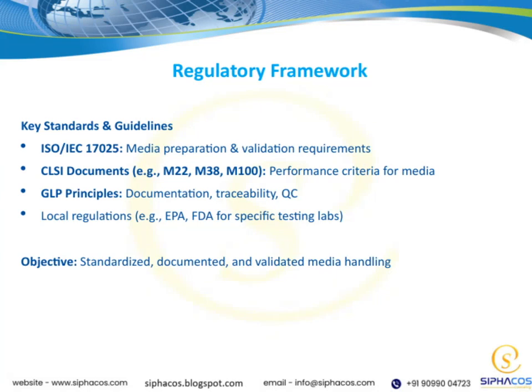Let's take a closer look at the regulatory framework that guides our media preparation and validation processes. First, we have the key standards and guidelines that set the foundation for quality and consistency. One of the most important is ISO IEC 17025, which specifies the requirements for media preparation and validation to ensure reliable testing results. Then there are the CLSI documents, such as M22, M38, and M100, which provide detailed performance criteria for media quality and performance.